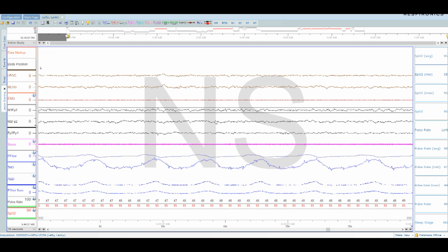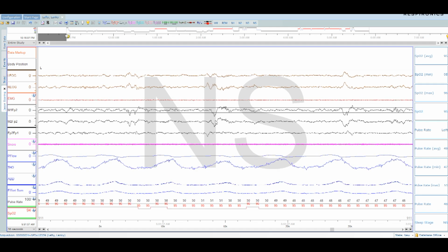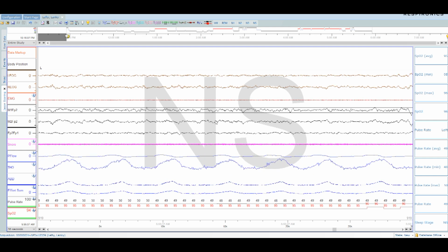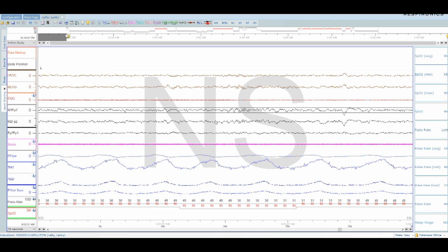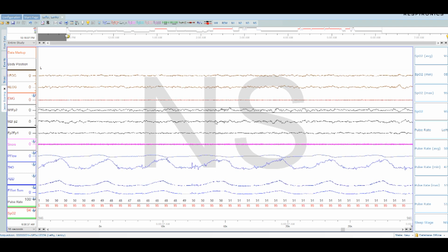Those are the people that fall through the cracks throughout life, feel like crap and don't know why. It's probably because they had an RDI that was through the roof, or crazy high, with an AHI below 5. And on the sleep report, those people will typically see a bunch of spontaneous arousals. Well, why so many arousals? It's because they were really RERAs that weren't even scored.